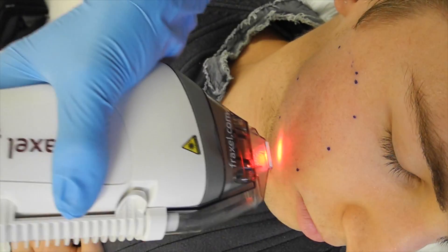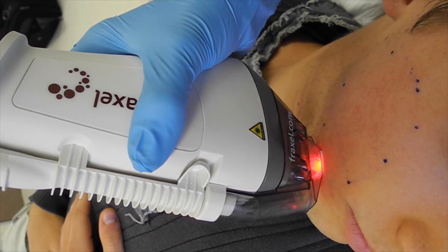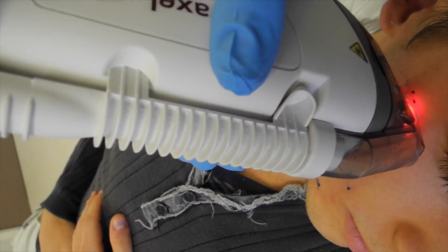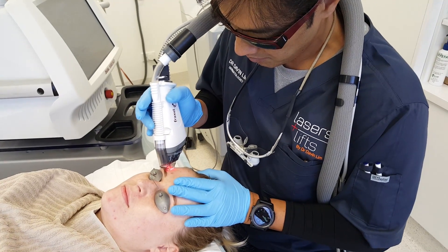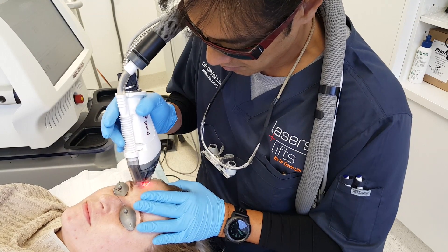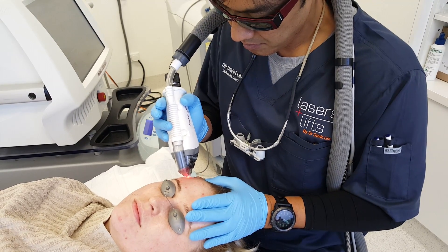The first example I'll use would be a Fraxel laser. This is a Fraxel 1550 laser, and it's good as an all-round laser for basically scar revision. It's not great for one particular purpose, but great for a multitude of purposes — it's like a Swiss Army knife, really. Here, I'm performing a Fraxel 1550 for skin rejuvenation and acne scarring. The downtime following this type of laser procedure is about five days.